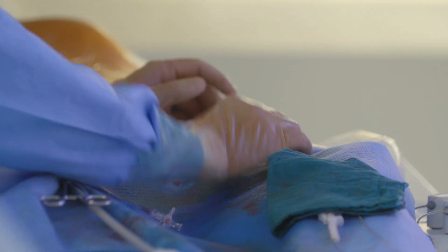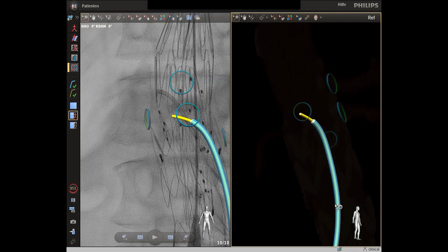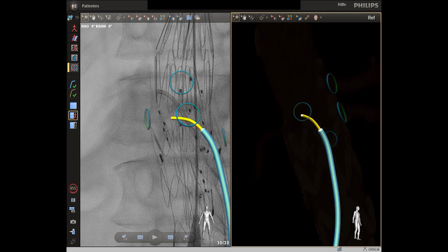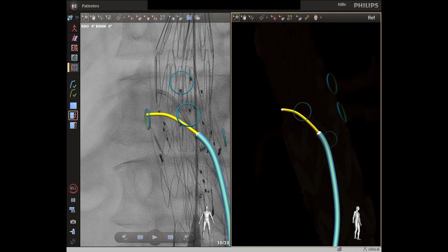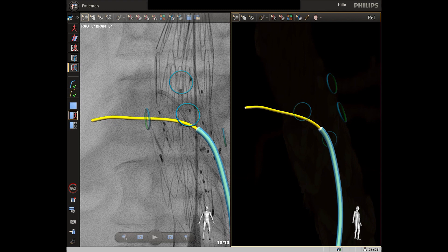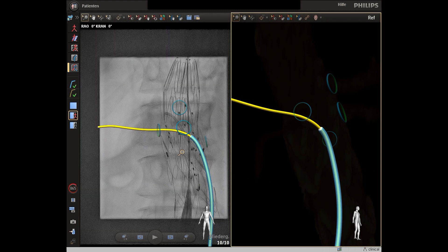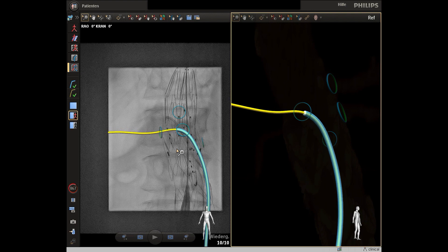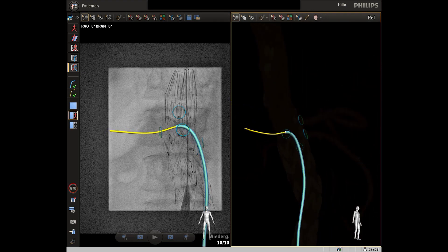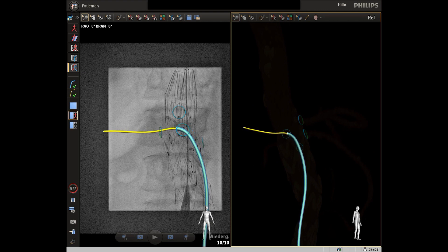As a first target vessel, the right renal artery is used in this case. You see the use of a FOSS Cobra catheter in combination with a wire that easily accesses the fenestration, and that is controlled in this biplane view. The zoom can be adapted so that you keep the wire tip always in your field of vision, and then the FOSS catheter is advanced over the wire into the target vessel.